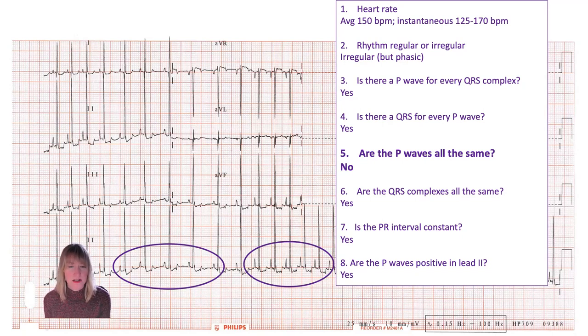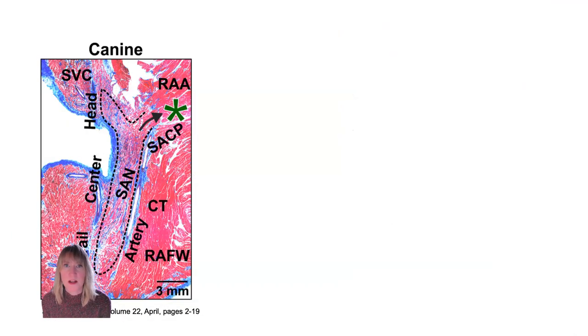If we come back to this idea of these different P wave morphologies, I'm thinking, are they all arising from the SA node, but just taking maybe a slightly different pathway through the atria to result in the different look, or are they indeed ectopics? Are some of these P waves truly not arising from the SA node and coming from somewhere else, an ectopic site within the atria? That's where some knowledge about the SA node comes handy, so let me share a little bit of that with you.